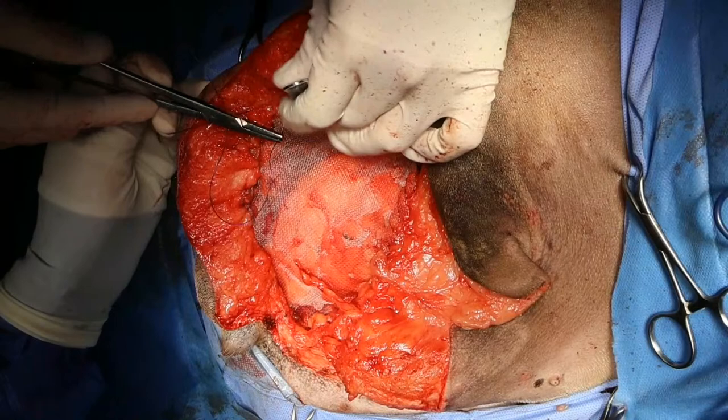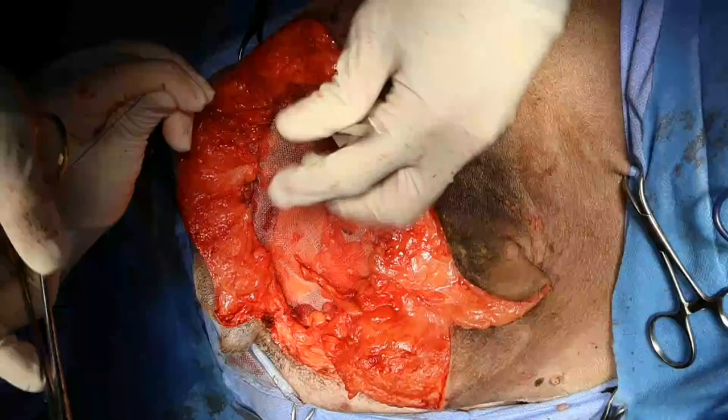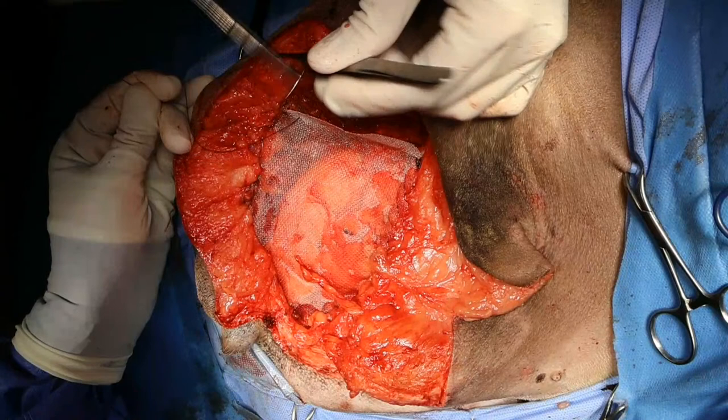And there's a question about why do I ligate later? The reason why I tend to try to wait on these is so that I don't have a false sense of security in thinking that I've ligated all the vessels peripherally, because what happens sometimes is that you think you've ligated them peripherally and then you end up cutting something that you haven't ligated already.